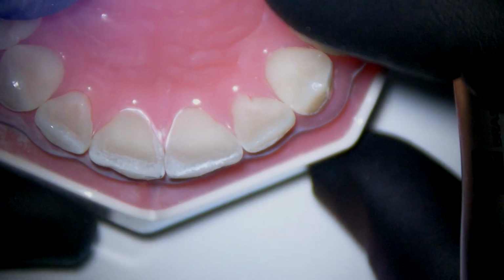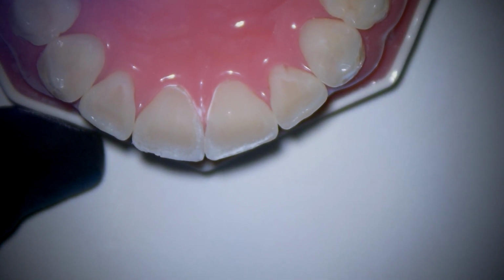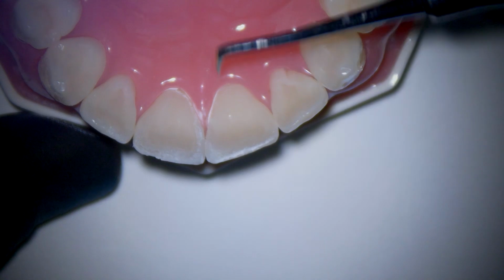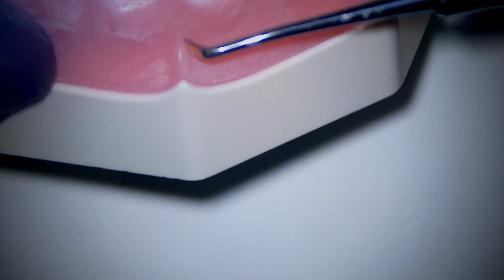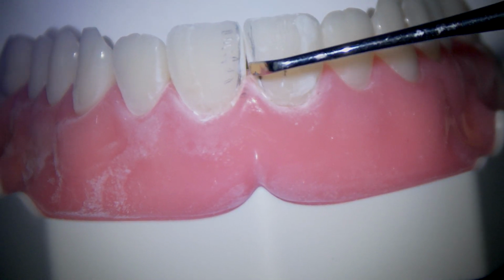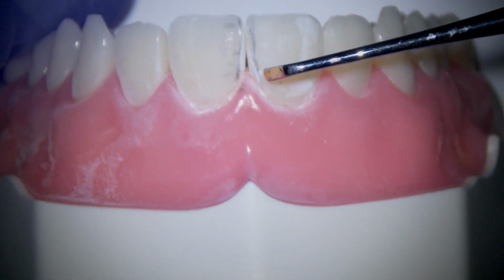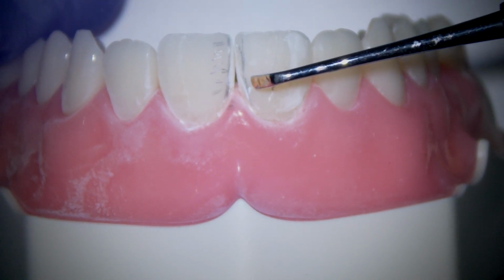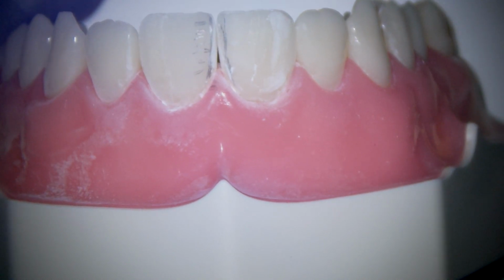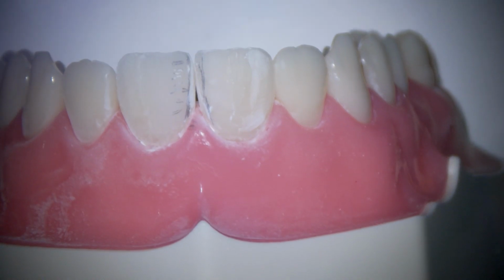When you're doing the contouring, I want you to be looking from the incisal. Again, as we talked about during the presentation, we're looking for the proximal contact to be towards the palatal, so we can de-emphasize the facial sides, because we're going to be bringing in these facial contours so we can prevent having the tooth look too wide. So as you're working with your contouring disc, if you see this white line right here, you might need to get a new clean disc.